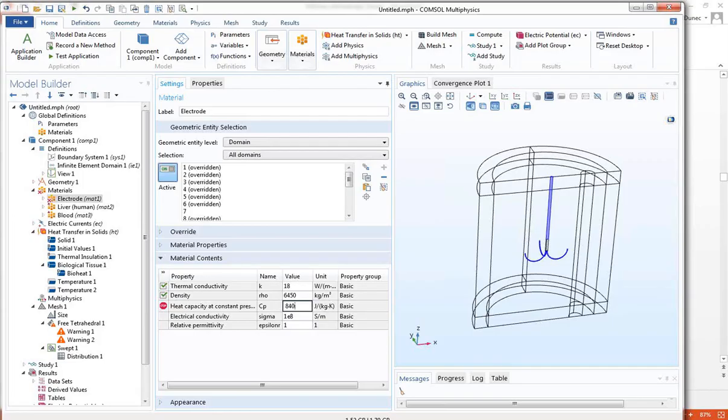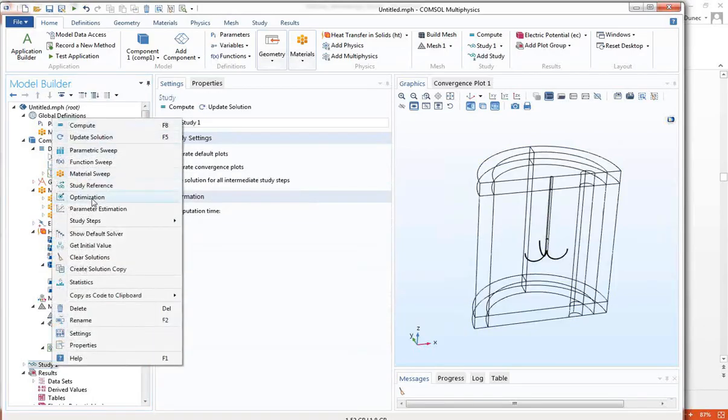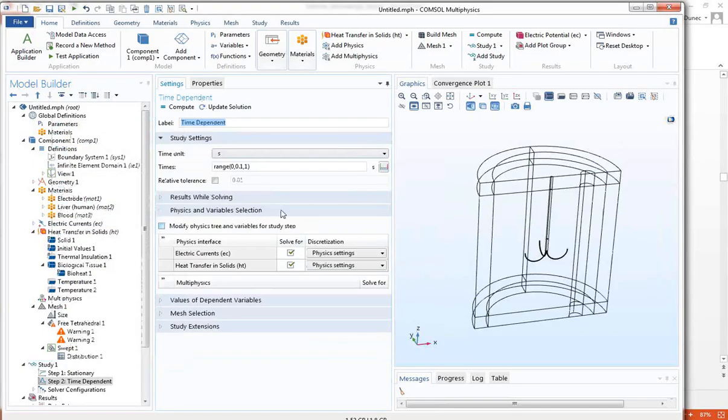Now, I've got the temperatures set. For those people that are worried, wait a minute, you almost didn't do the infinite elements. If you notice, that's up at the component level. So it's already being used. So those of us that missed that the first time, I'm not going to have that problem the second time. Okay, so now let me go in and add a study. Right-click. I'm going to go in and add a study step. We'll do time-dependent.